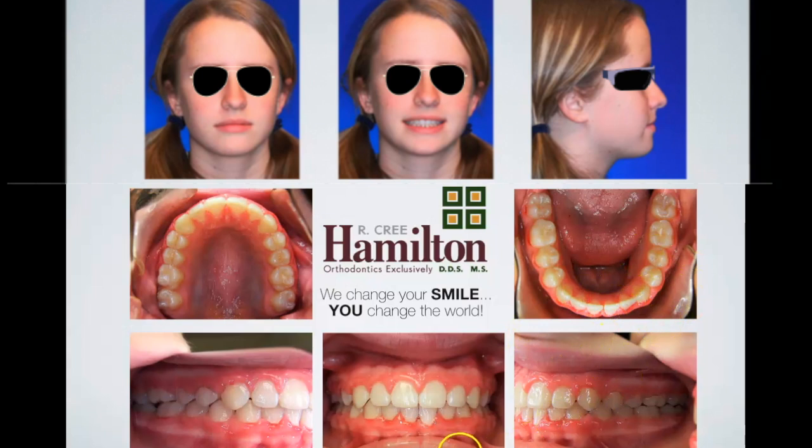Now, this is actually one of the things that I feel is one of the biggest benefits of customized treatment, right? This case was treated without any sort of customization. It was old school, with plaster models, and we did indirect bonding with plaster models. We had no idea how good our bracket position was until we put wires in and saw what it did afterwards, okay?